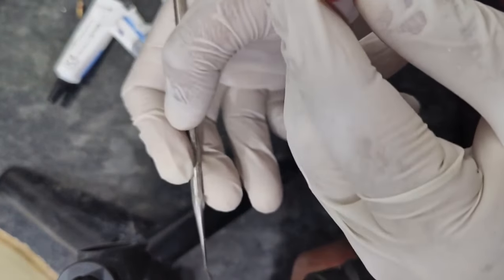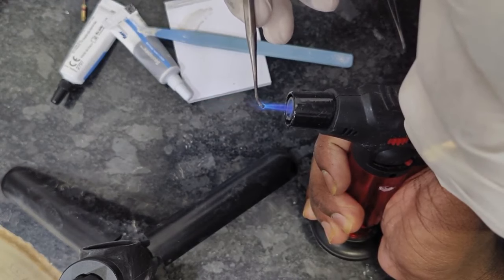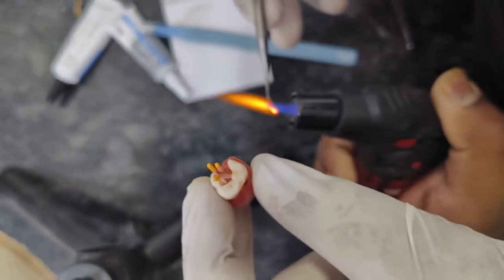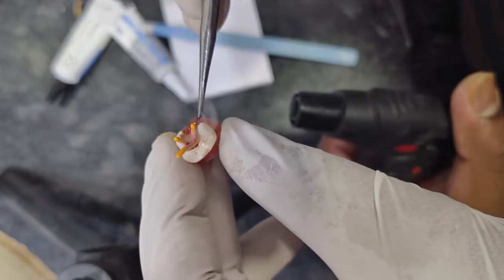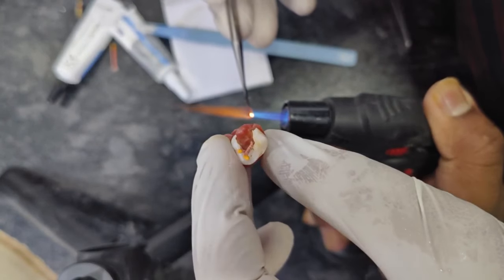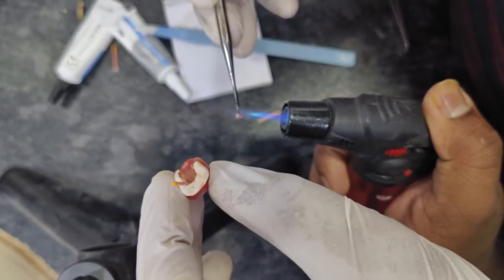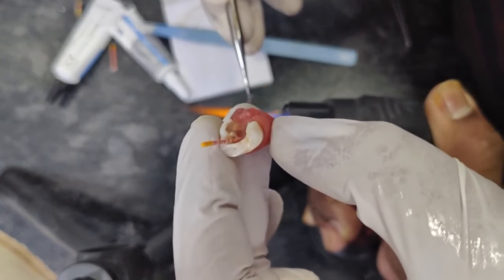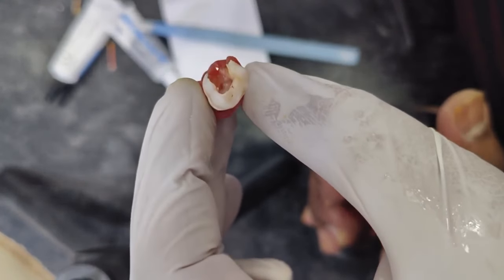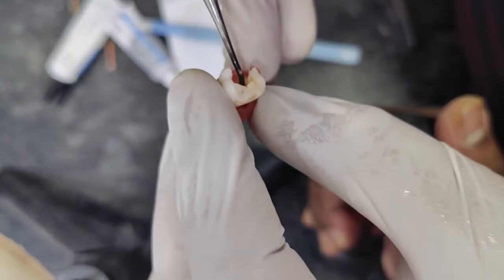We'll just heat the end of the gutta percha. And we have to take this burner like this. Usually in the beginning you can consider doing one GP at a time, but here I'll show you all the three GP together. So one GP obturated. While doing the obturation, be very careful with the patient so that this ball burnisher doesn't touch the mucosa of the patient, and just press it a little bit, and henceforth the obturation of this tooth is complete.